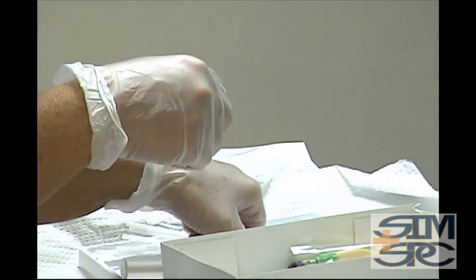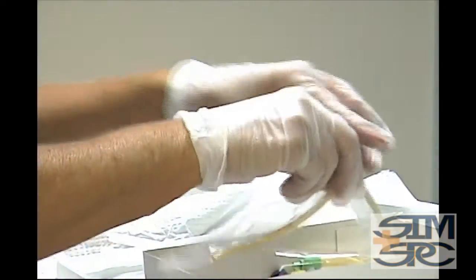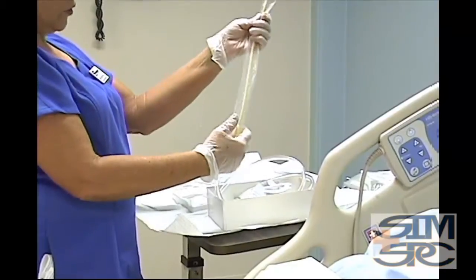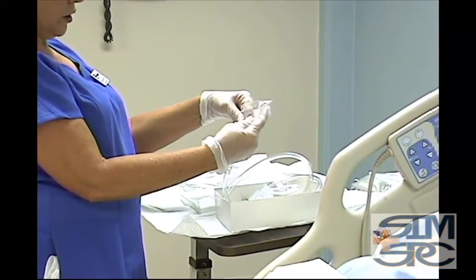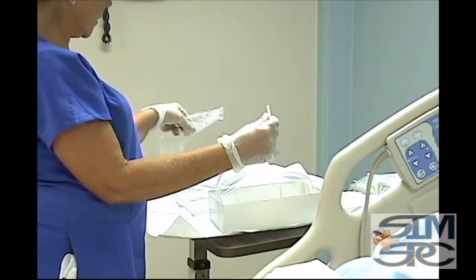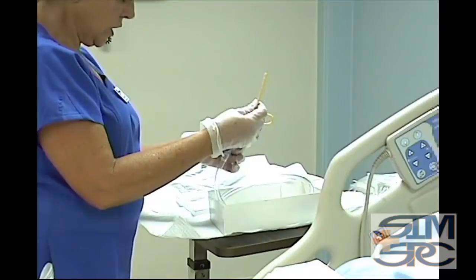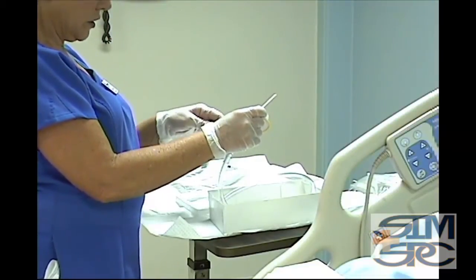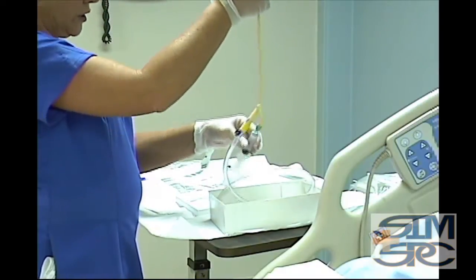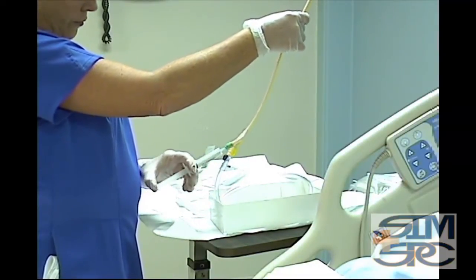Okay, now I'm going to go ahead and check the bulb. I'm going to get my catheter ready. It's twisted here, so we're going to untwist it. I'm going to wrap it because I'm going to pre-lubricate my catheter too, so when I transfer, it'll all be done. You need to wrap it around your hand because these are very flimsy and they'll go everywhere, so you need to have control over it. Then you're going to take where your bulb goes and push it on, and then you're going to just let it out. You need to untwist it, though, because if you don't, it's going to spray back on you. And then we'll check the balloon.